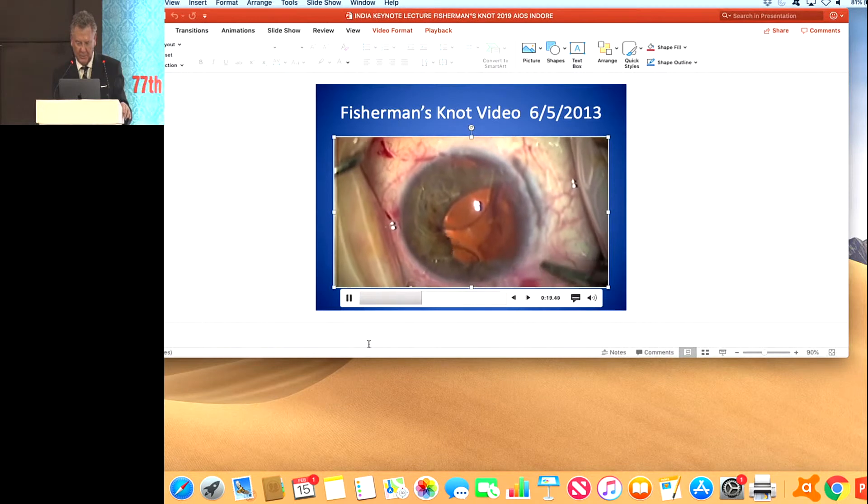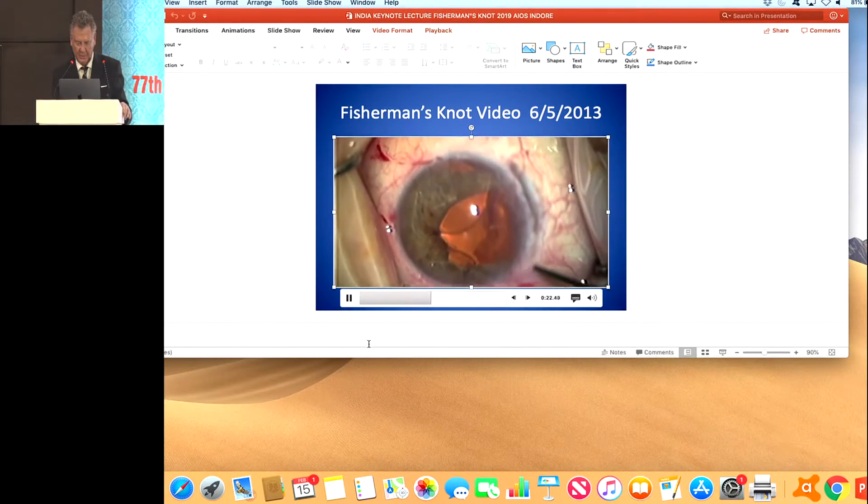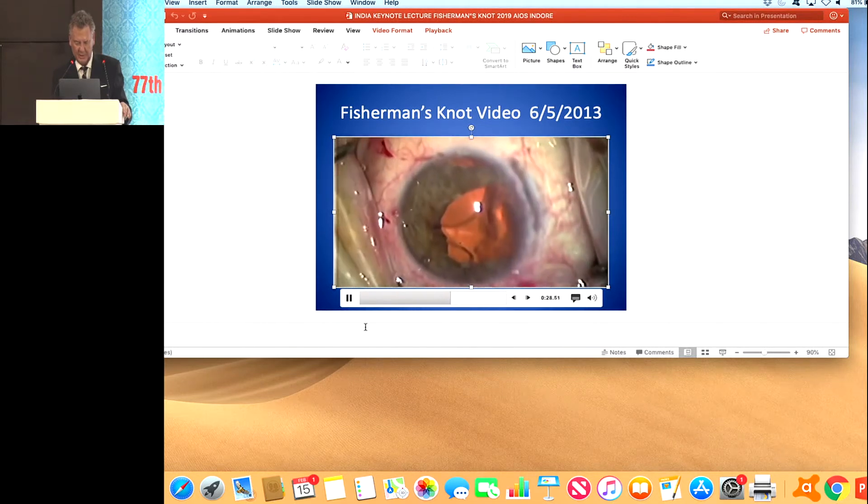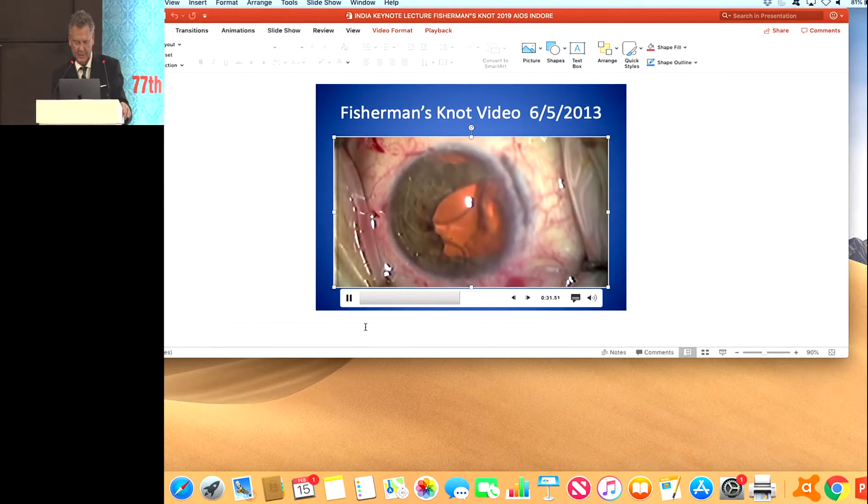Here we're twisting the loop five times, and we're going to pass the needle through the loop. Then pull the opposite ends, and that helps to close up the defect.